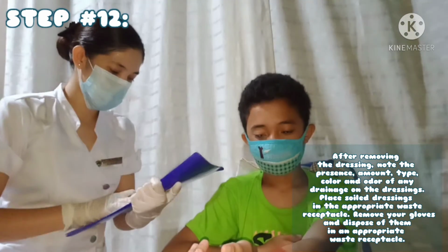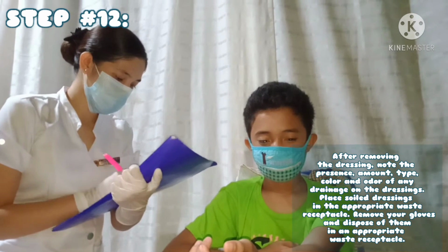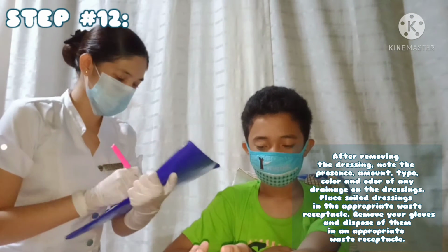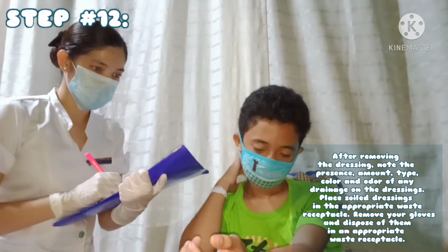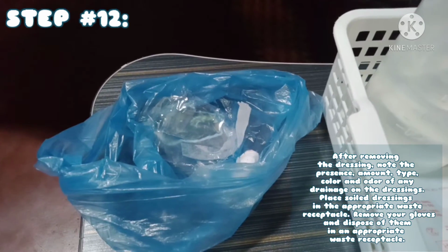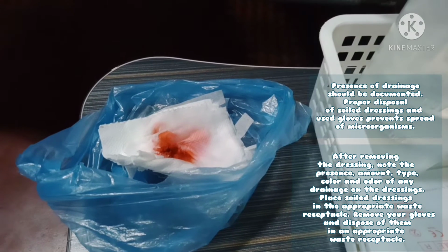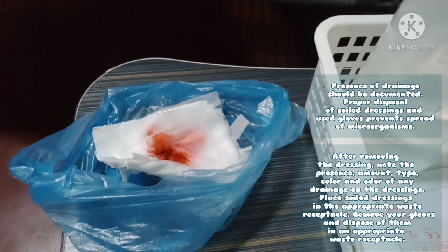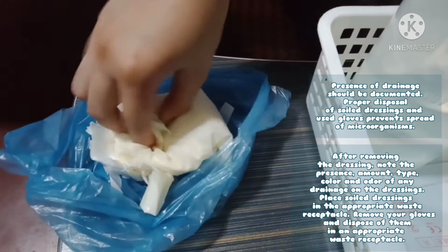Step number 12. After removing the dressing, note the presence, amount, type, color, and odor of any drainage of the dressings. Place soiled dressings in the appropriate waste receptacle. Remove your gloves and dispose of them in an appropriate waste receptacle. The presence of drainage should be documented. Proper disposal of soiled dressings and used gloves prevents spread of microorganisms.